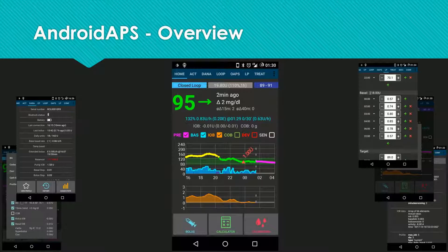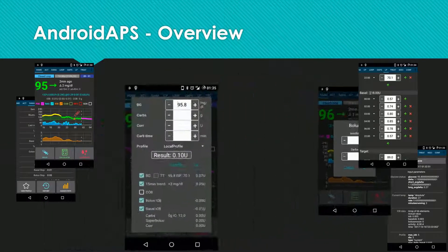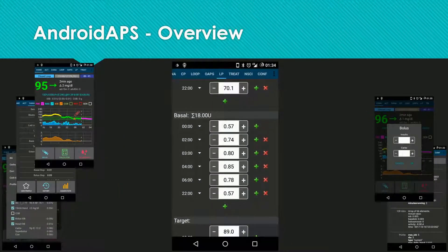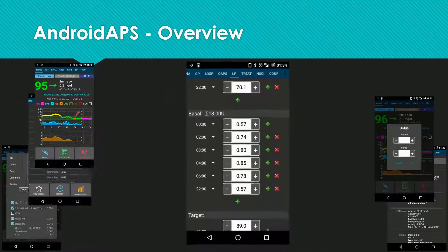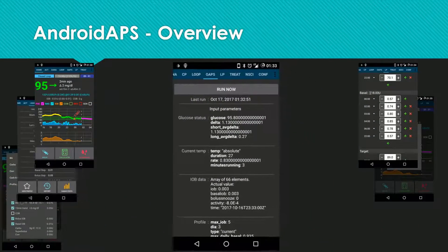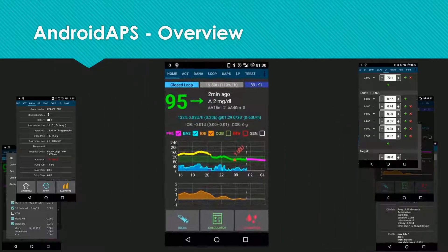In the upper right corner you see the current target range. Directly from the home screen you can do the most popular interactions, like temporary targets, bolus and carb entry, or use a bolus calculator. To get started, you set up your basal rate and carb factors. You can monitor the pump states. And if you want to go into detail, you can see all the internals of the algorithm. But when everything is set up and running, the home screen is mostly all you need.